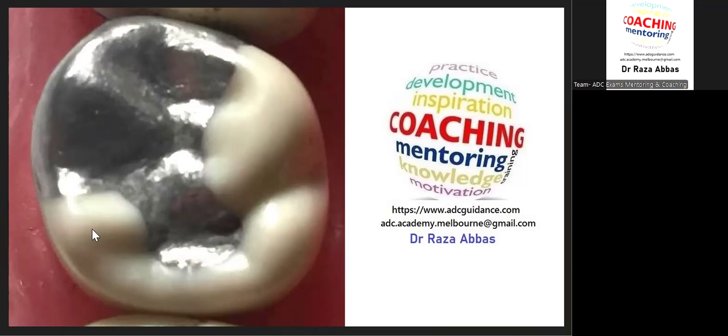Now let's assume a situation. You are having a situation where a fracture of the amalgam happens and you don't have any time. Let's say this part fractures, right? Let's assume the cusp portion fractures. It's okay. You don't have time. In the existing amalgam restoration that you have in the base, create a hole, mix a new capsule of amalgam, and start condensing. That will work as well. So, like I said, you have to work your way out. The outcome matters, not how you achieved it.